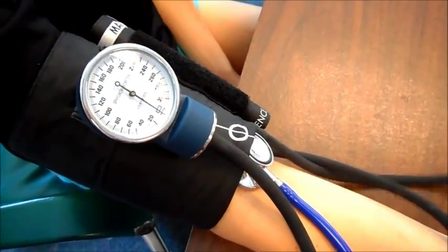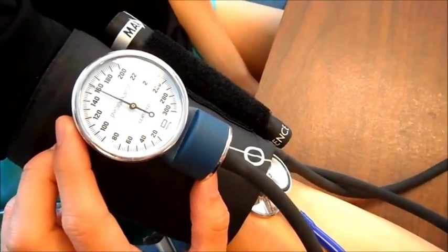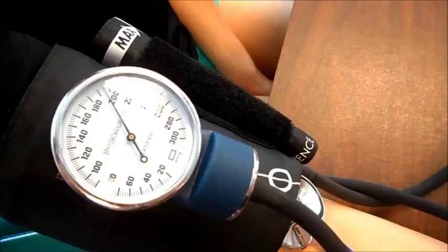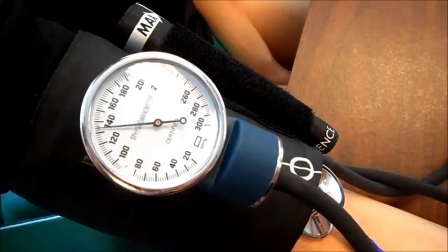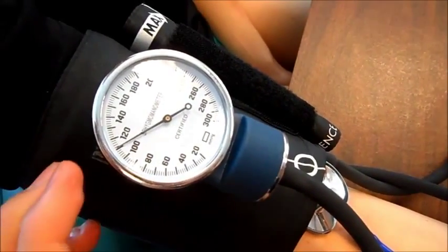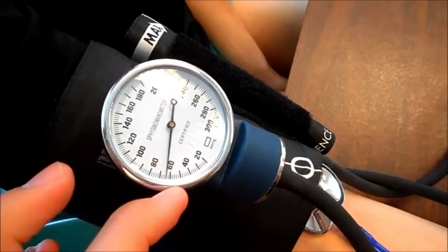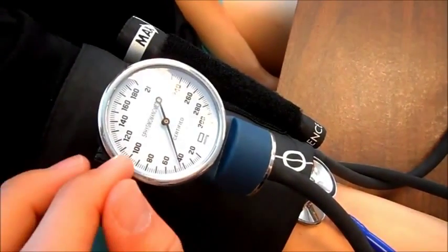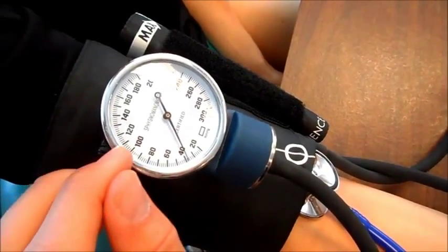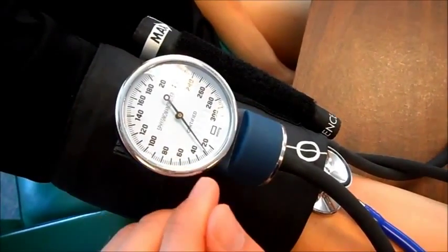Pump the cuff up to about 200, then slowly let some air out. The first thump I heard and the dial started bouncing at around 118, and the last thump I heard was at about 64, giving a reading of 118 over 64. You'll see the dial go up and down as you release the air.